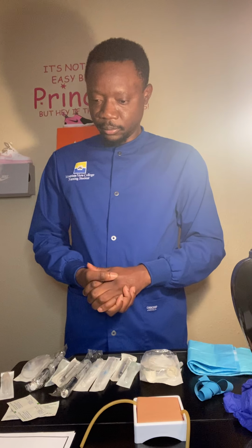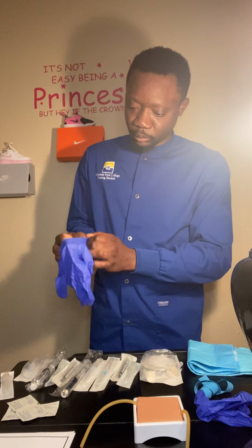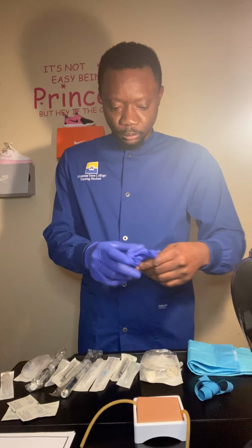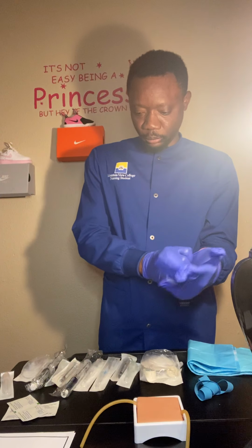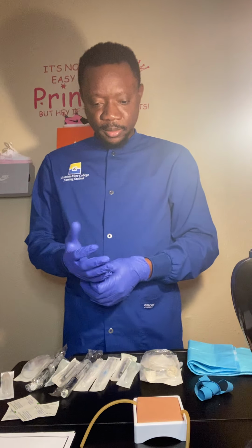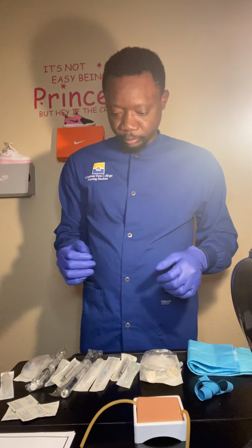So I'll make sure that the area I want to start the IV is good and looks healthy before I start, and then I'll perform my hand hygiene, and then I'll put on my gloves. So I'll leave the patient bed at my waistline for easy maneuvering.